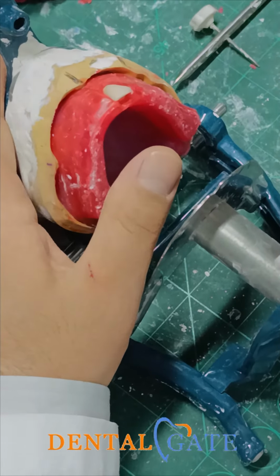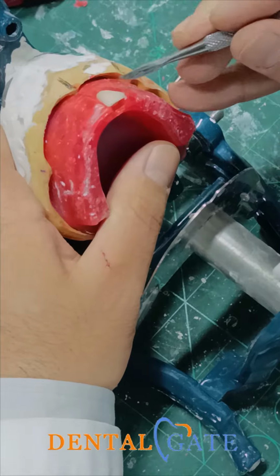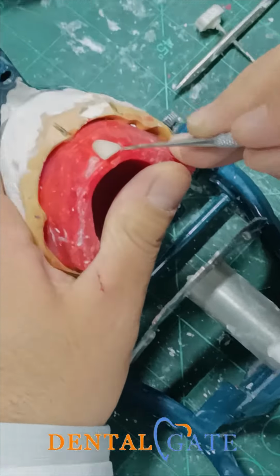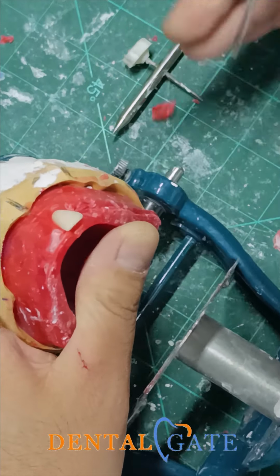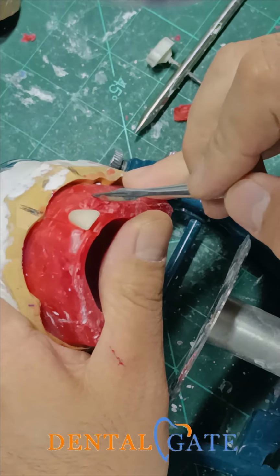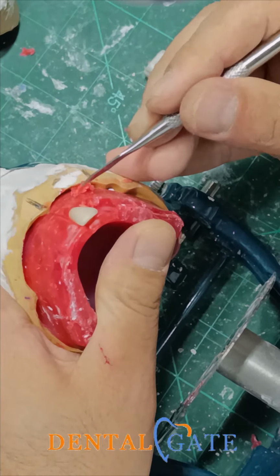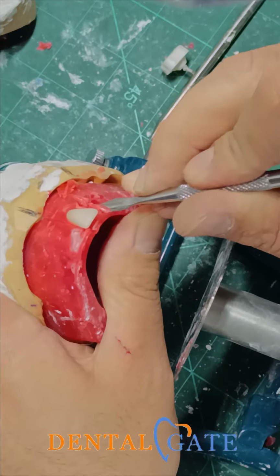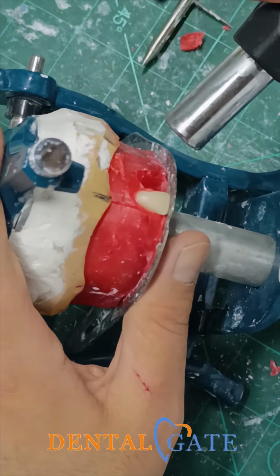Now regarding the lateral, make a socket for the lateral. Remove a sufficient amount of wax to prepare a socket, and keep cleaning, because if there is no cleaning here, the wax will lose its properties.